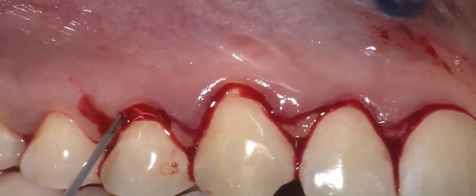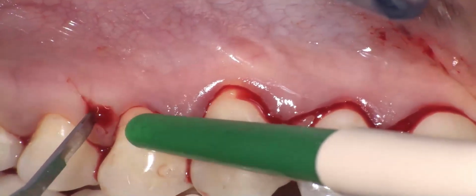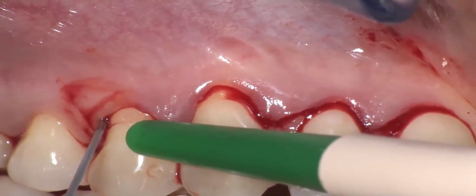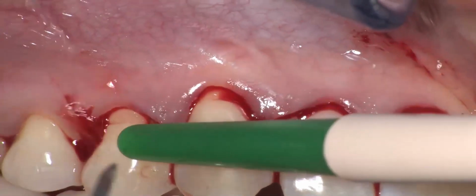deeper. I take the tip, trying to give the right triangular shape.